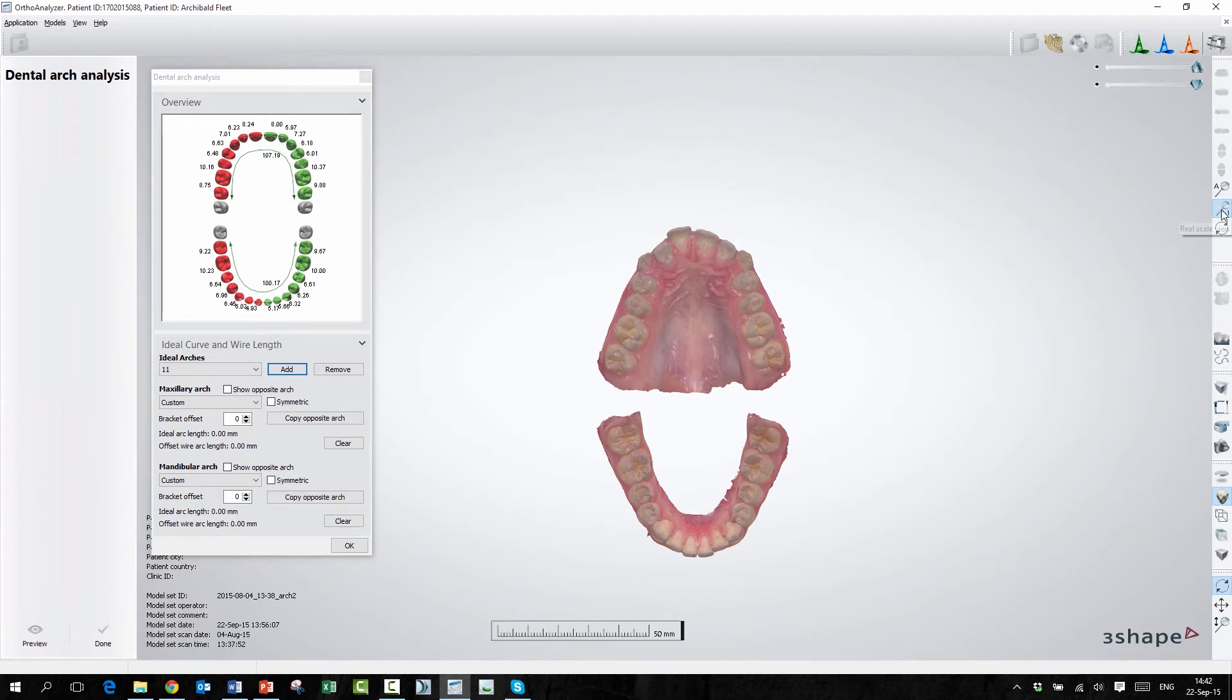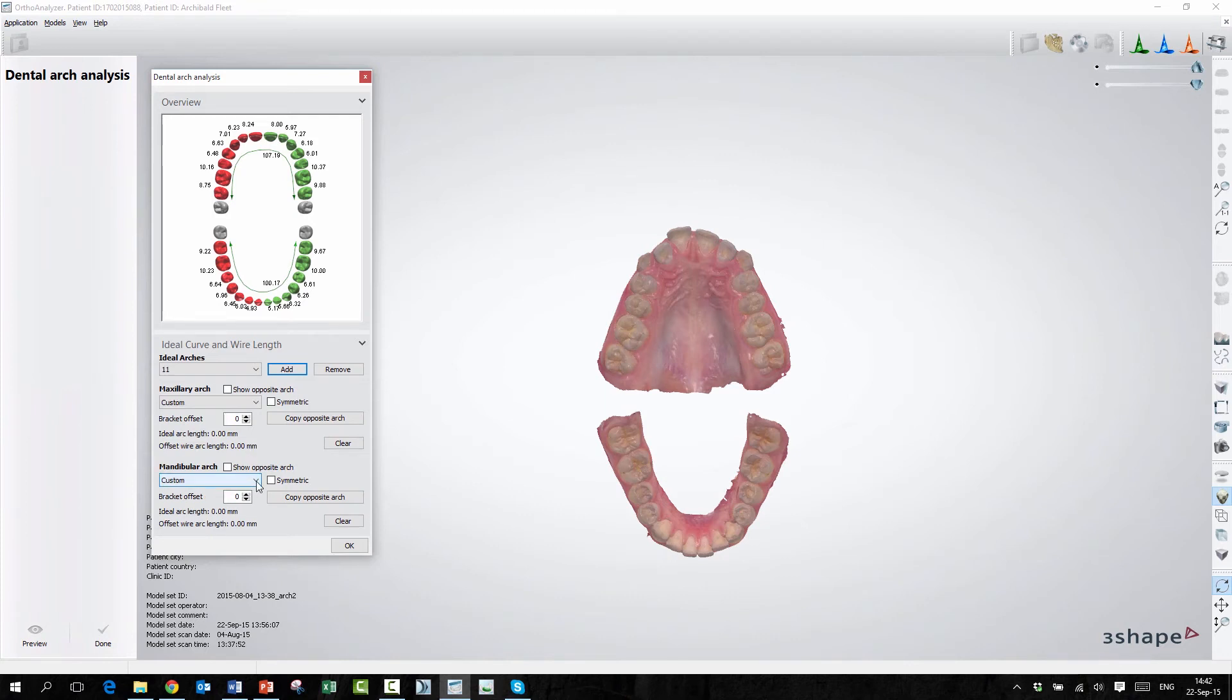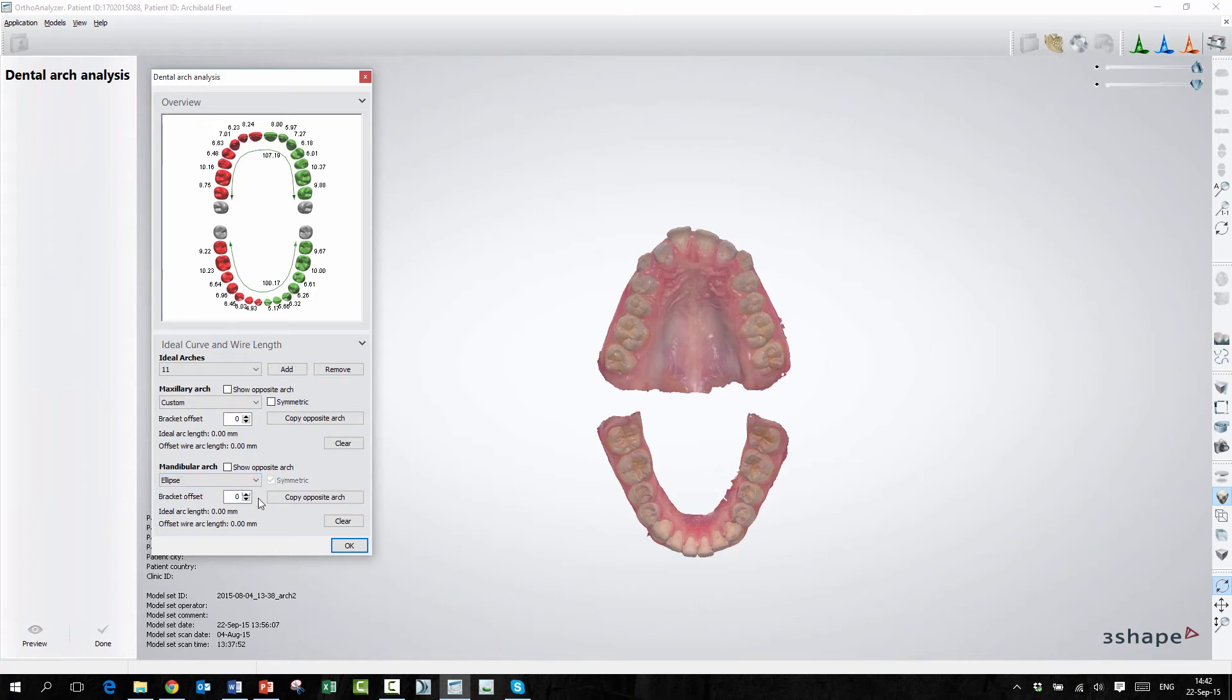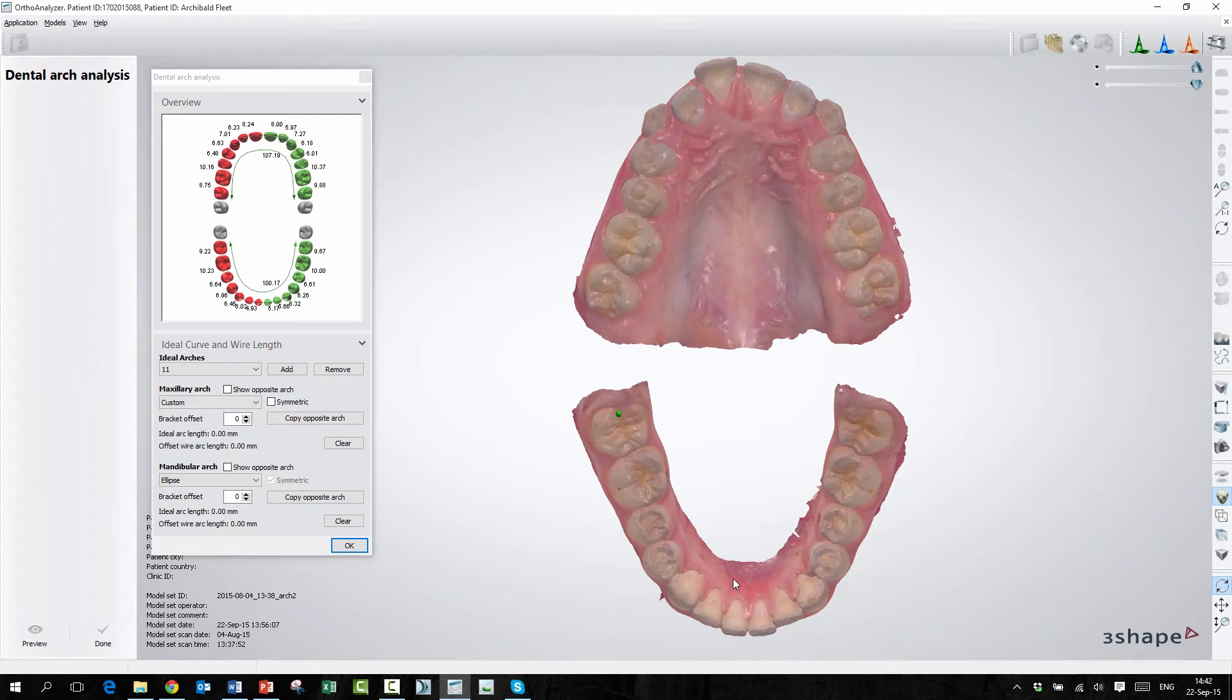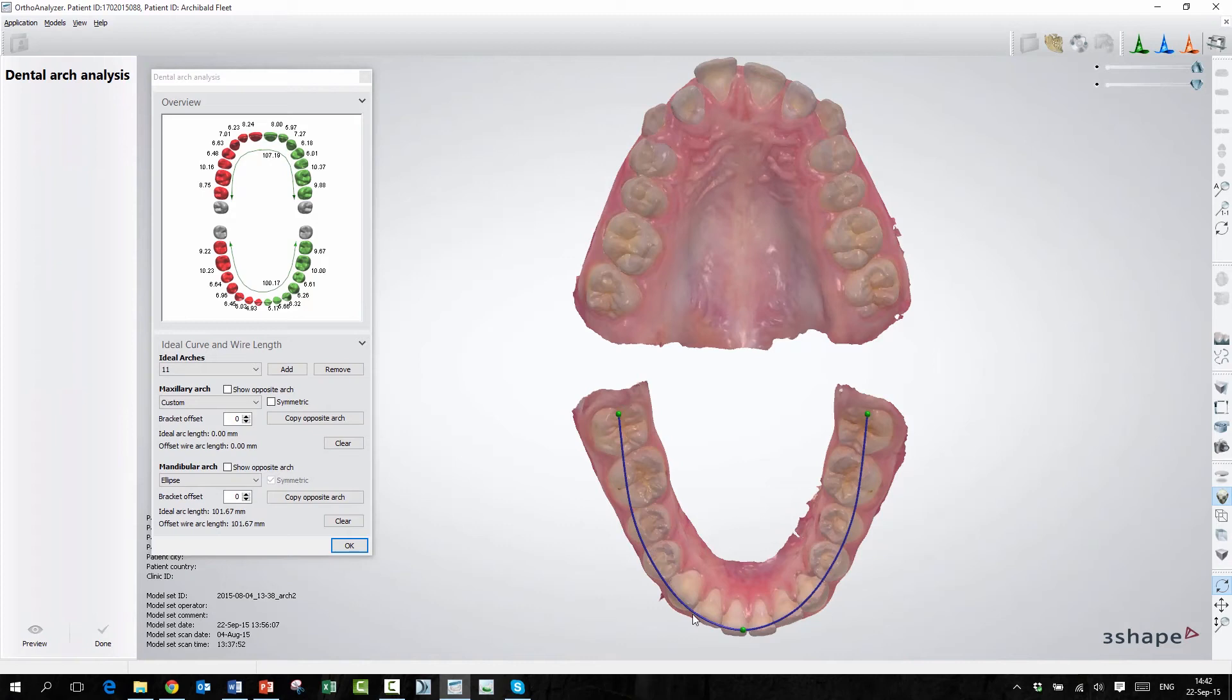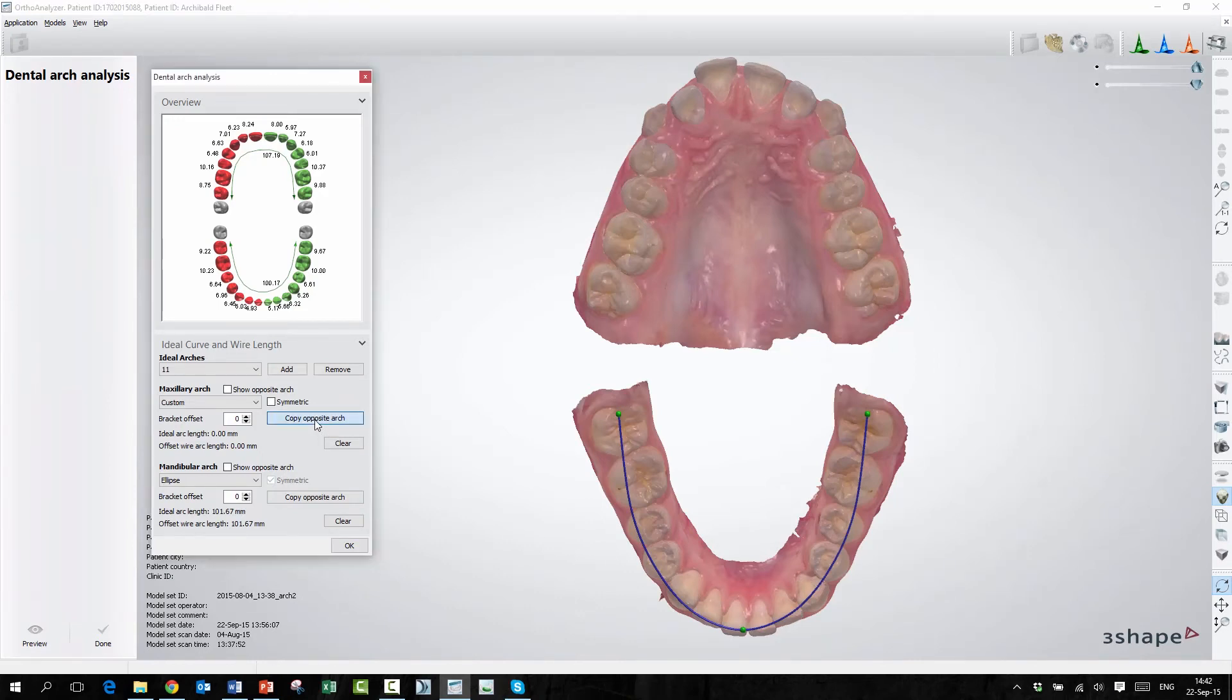So now I want to make an arch in the lower jaw. I'll use symmetric again. I will choose a different one, and I will just set some points here. I'll just make it a bit bigger. And now for this arch, I will only have to use two points. So this is a preformed arch. So again, if I want to copy this arch, I'll just copy opposite the arch up here.